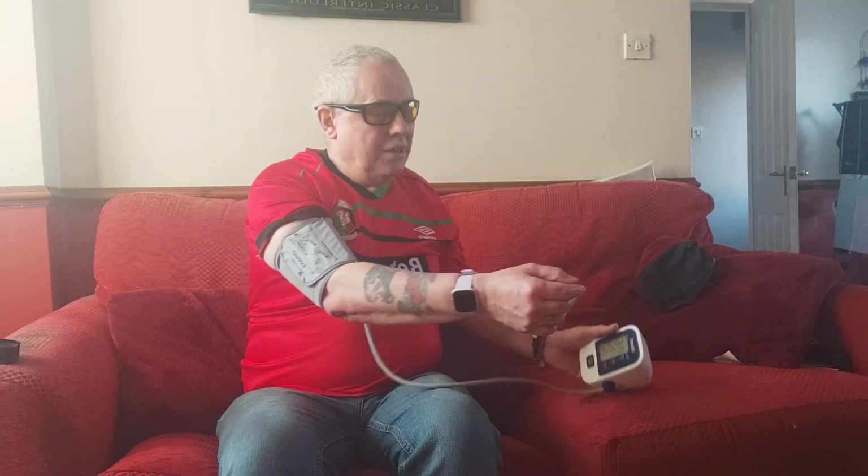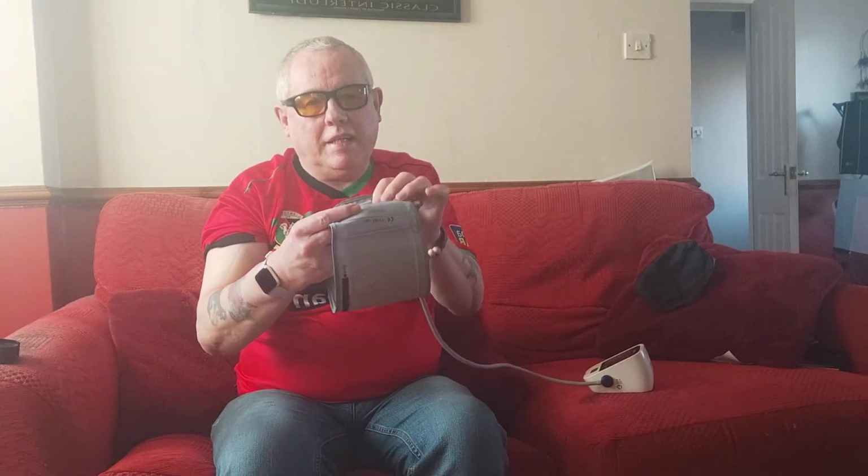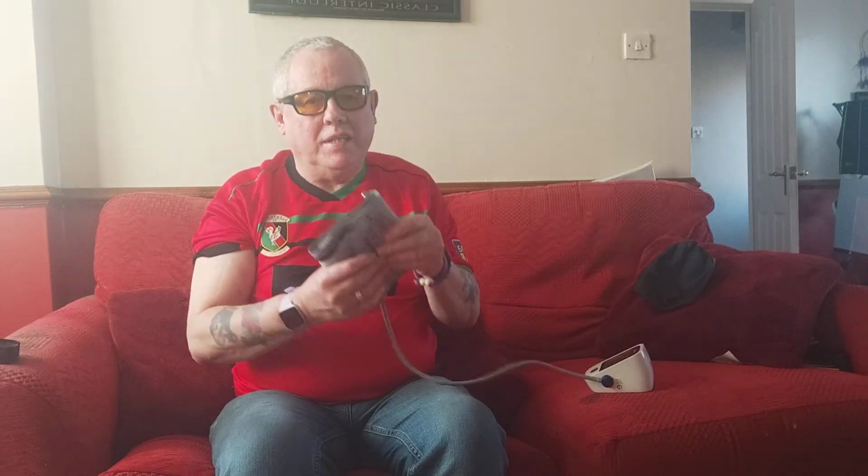But then you just get the machine off, and then just peel that off. Off she comes. I never actually take that right out. I just leave it and then pull it back and attach it. Makes it much easier when you go to use it again. And then you just put it away in the wee bag and that's you.